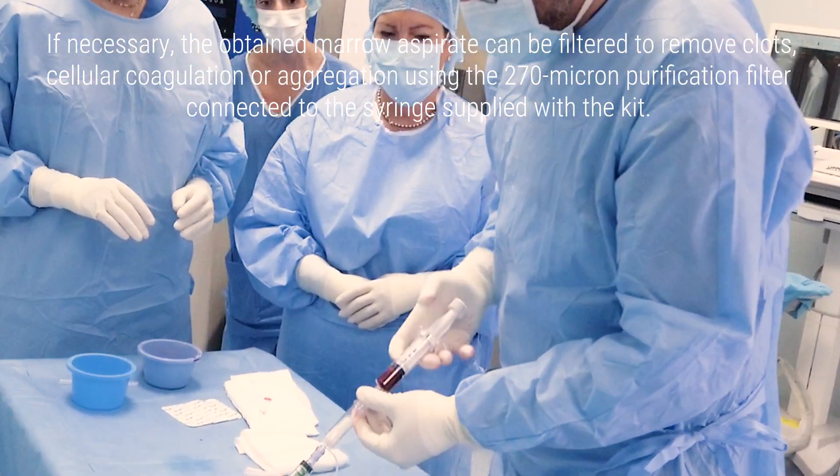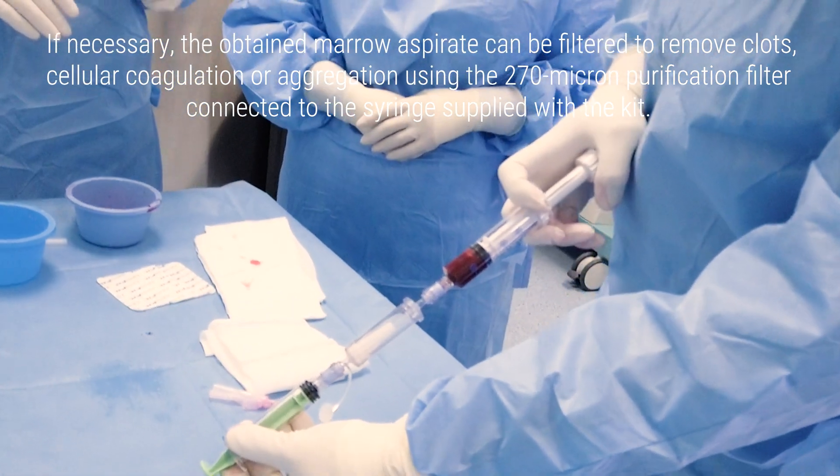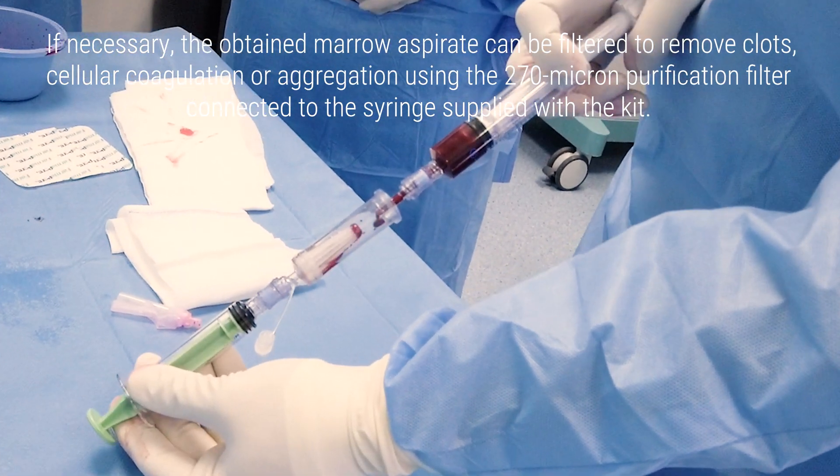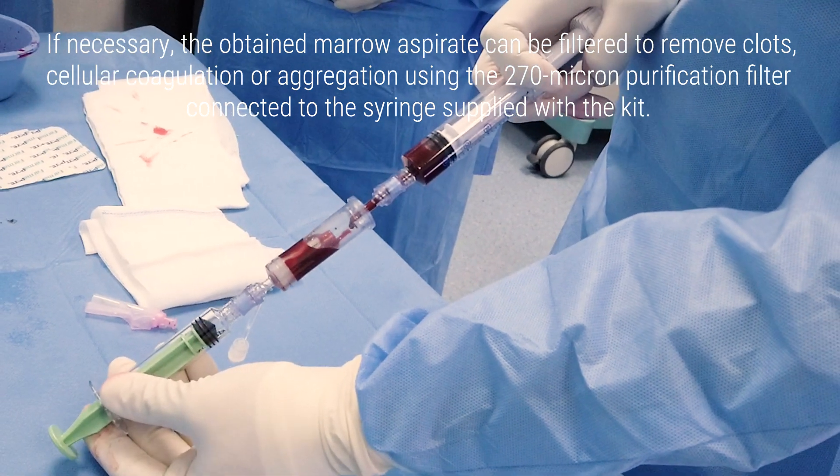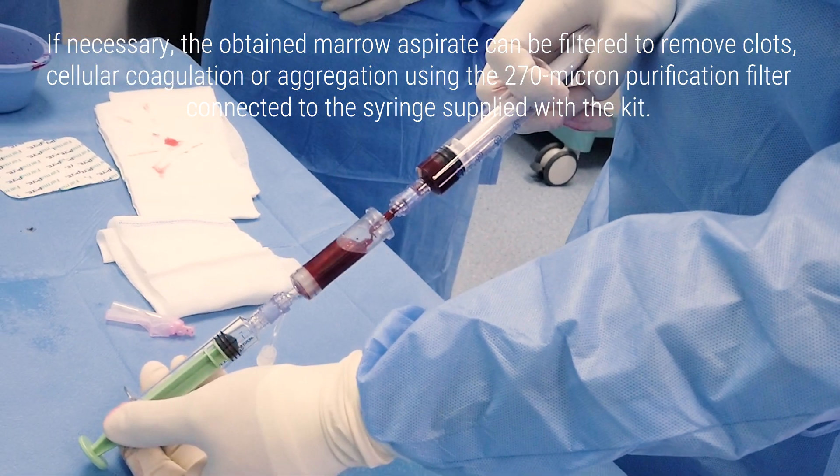If necessary, the obtained marrow aspirate can be filtered to remove clot, cellular coagulation, or aggregation using the 270-micron purification filter connected to the syringes supplied with the kit.